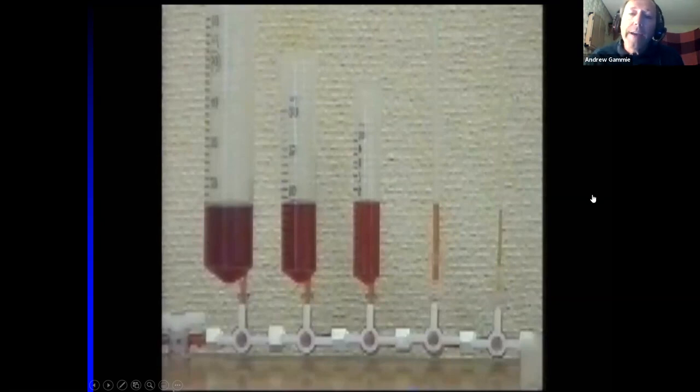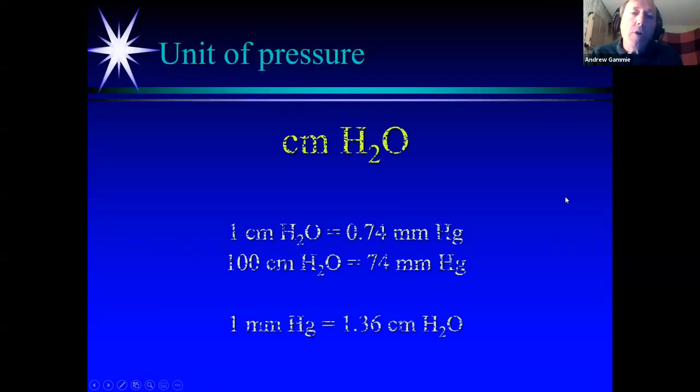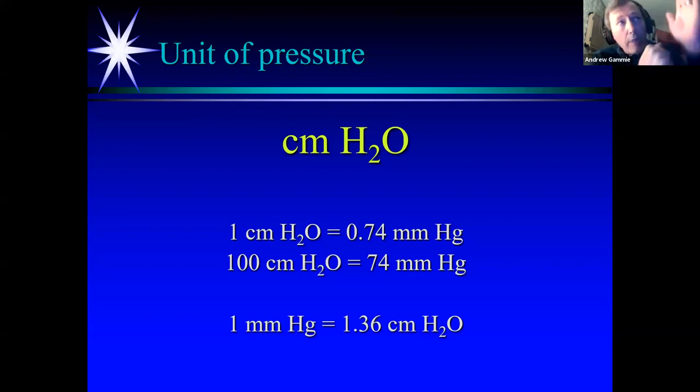And that is why in urodynamics, we use the unit of pressure as centimeters of water. We're talking about the number of centimeters of water that that pressure will hold up above me. Or if you like, if we're in a bladder, that you hold up above the bladder. If you had a tube of water connected to the bladder, how high would that tube be? That's what we're saying. And you can see here that we've got an equivalence with a measurement that you know very well, millimeters of mercury.